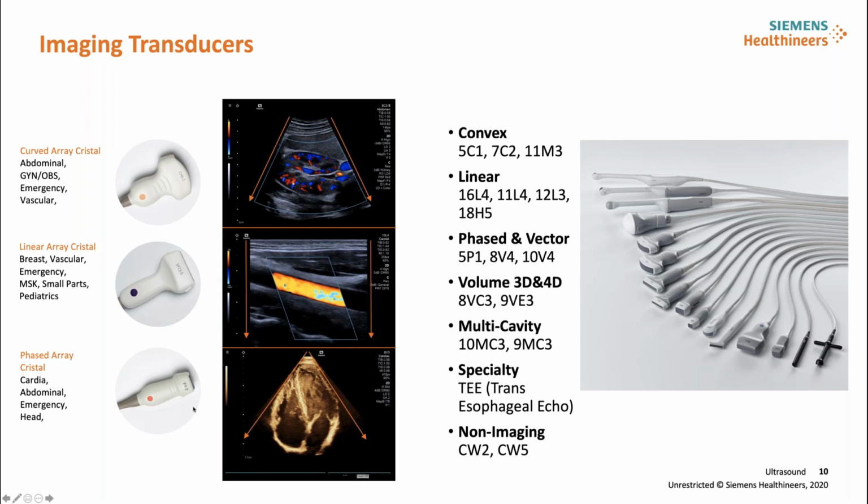And a third type of transducer, which has a square shape, is called phased array or echo probe. It's usually used in cardiac. It has a specific shape because the heart, as you know, is behind the ribs, and we can't do ultrasound of the bones. We have to avoid the bones because they completely block the sound. It's not going through like the X-ray.